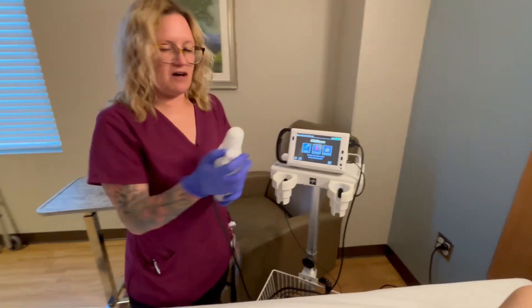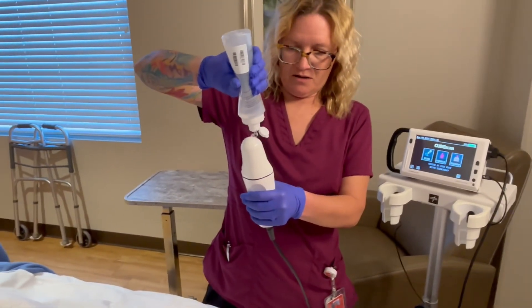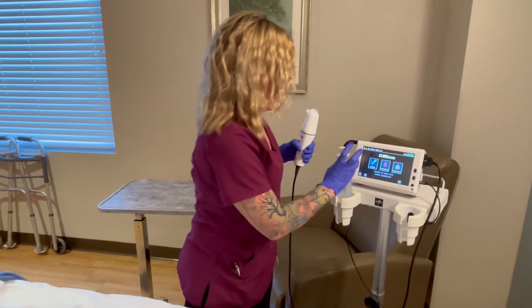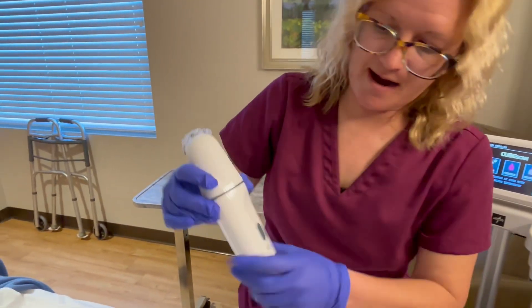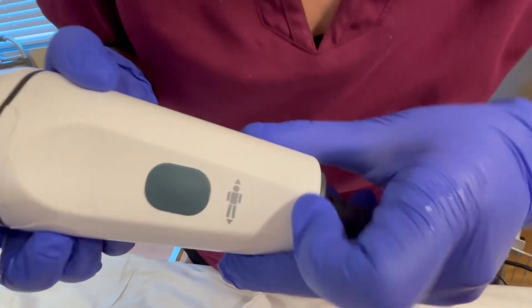Then I'm gonna take my gel and put a large amount on here to check the bladder. When I do this, I look at the indicator here — it shows which way it's supposed to be facing.